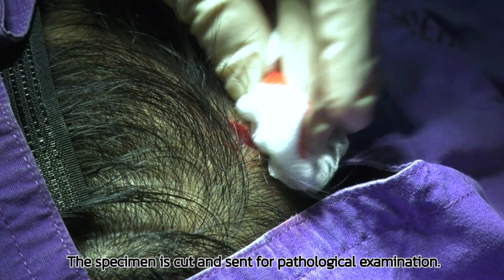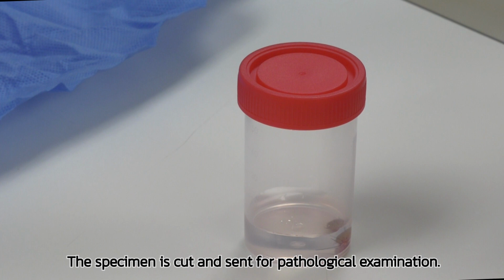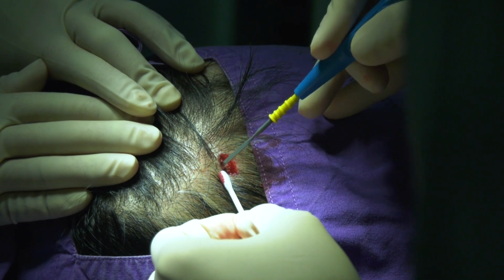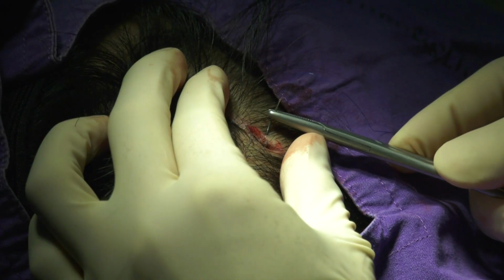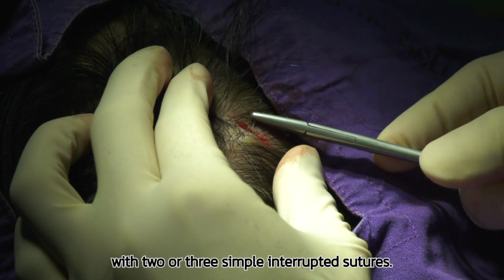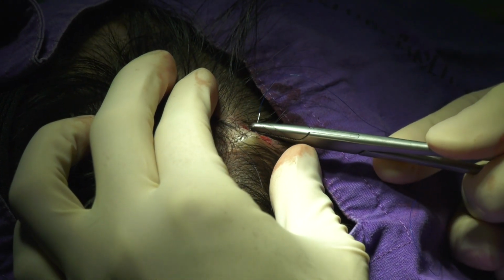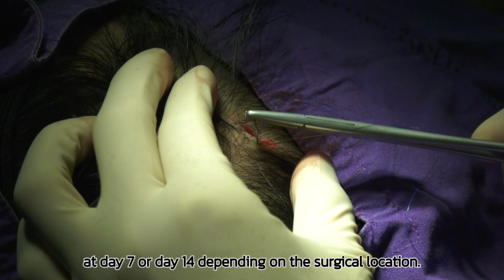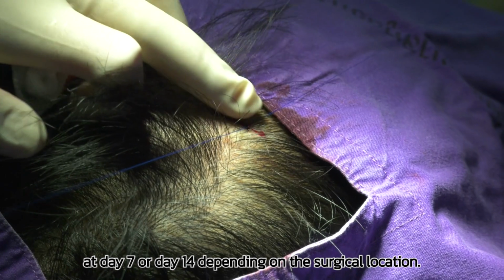The specimen is cut and sent for pathological examination. The wound is closed with 2 or 3 simple, interrupted sutures. The follow-up visit is scheduled at day 7 or day 14, depending on the surgical location.